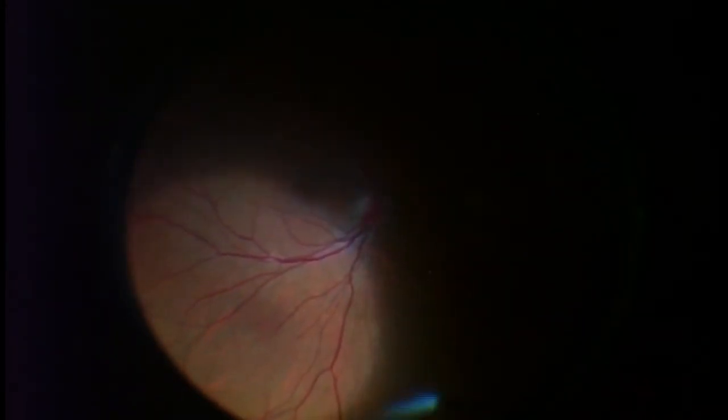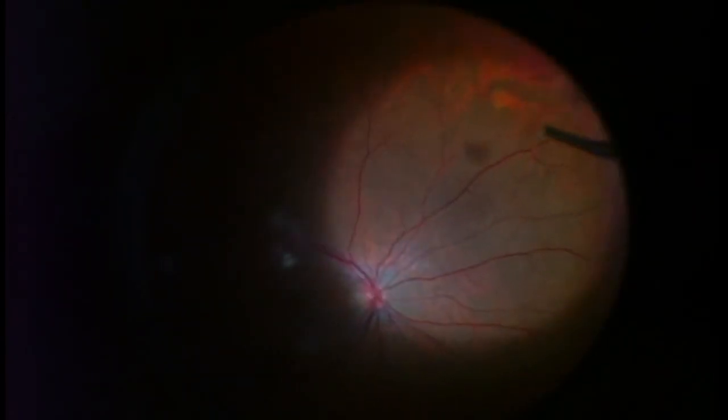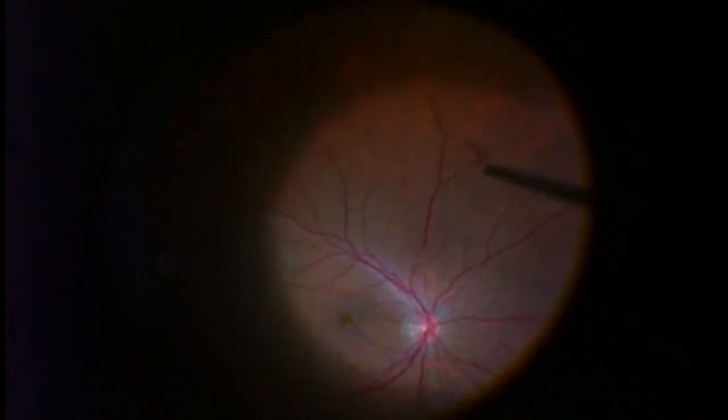This is his left eye, so the vitrectomy instrument starts out in my left hand. I want to go over to the far periphery to remove as much vitreous on the side as I can without causing any damage. We're going to switch hands with the instruments — the vitrectomy instrument is now in the right port because it's in my right hand. I want to get the area that was more difficult to access using my left hand, but I've already done the bulk of the work.